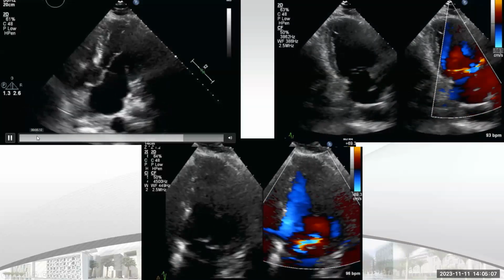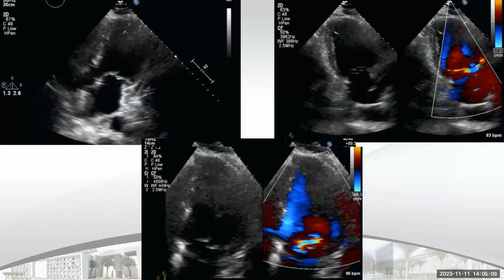This leads to very eccentric mitral regurgitation, which is anteriorly directed. Even going back to 2D, you can notice that there is some flail here. However, I think you have the privilege in the exam that you can freeze the image and move it step by step to know what's the problem there. Okay, what's the grading of MR here? Is it mild, moderate, or severe, and why?